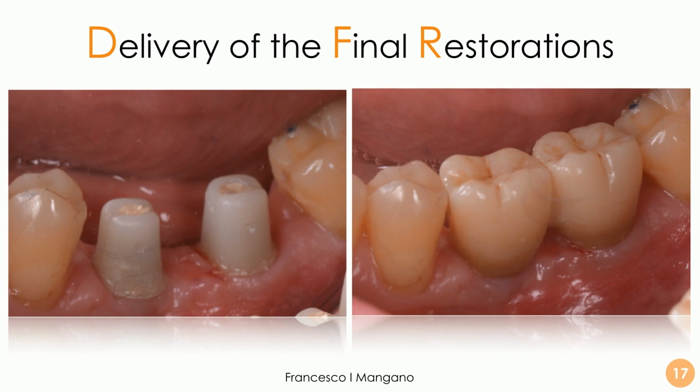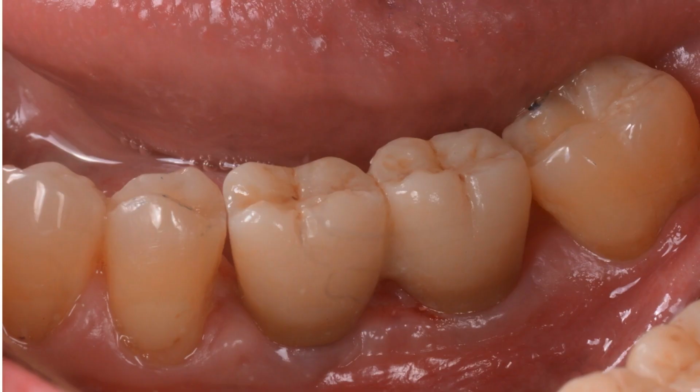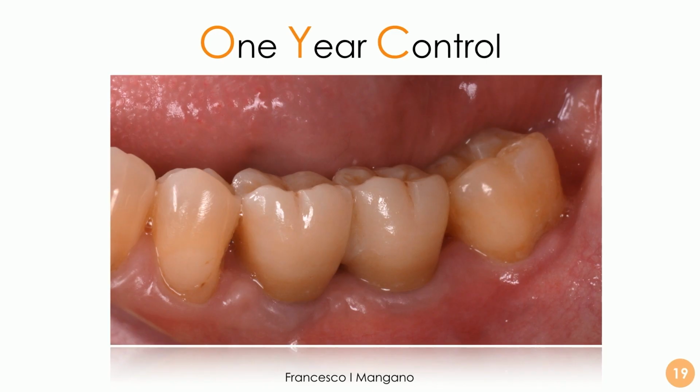And these are the final restorations at the delivery, as you can see here. And basically this is the outlook of our restoration, our monolithic zirconia bridge, perfectly integrated into the mouth. And 1 year after, the control revealed a perfect integration and stability of the soft tissues, even in the area of this minor bone regeneration.